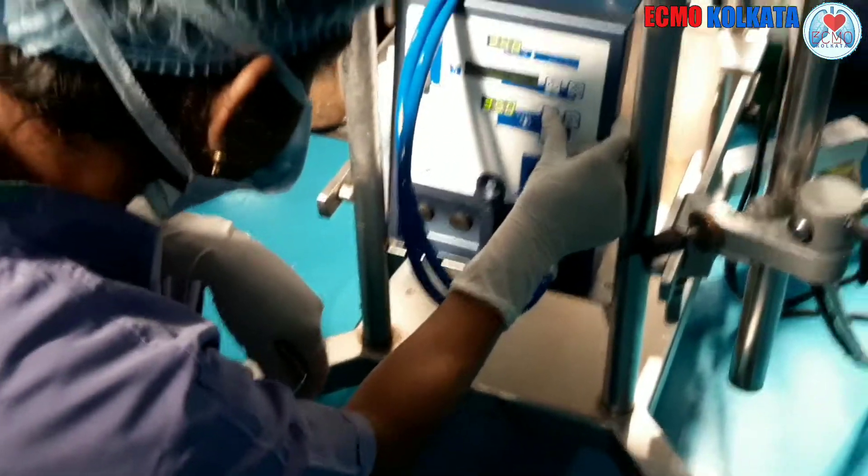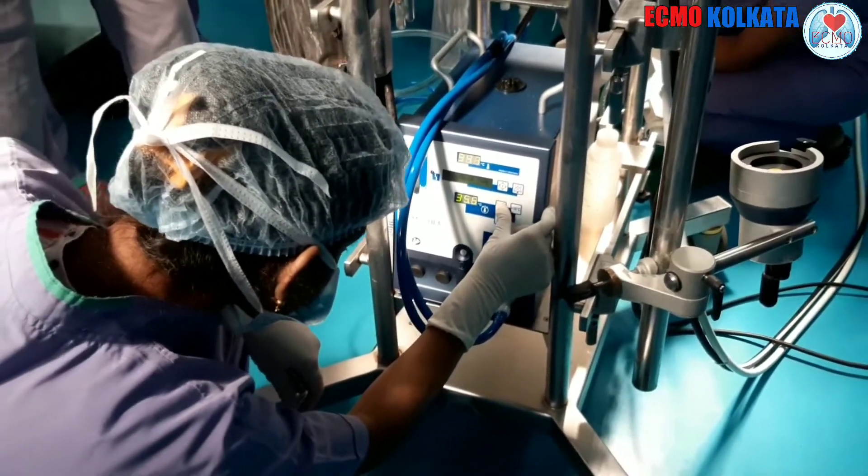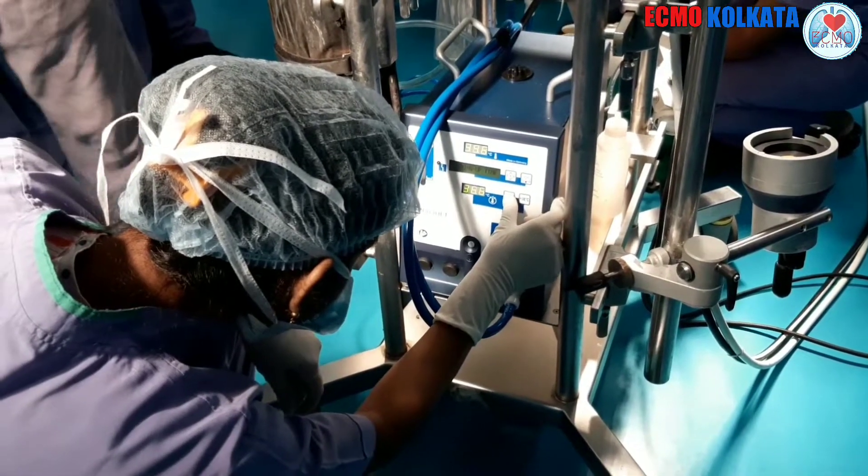Setting the temperature to the desired temperature.